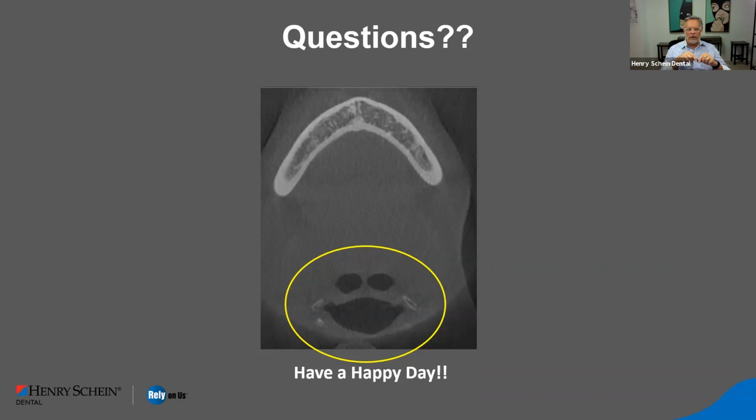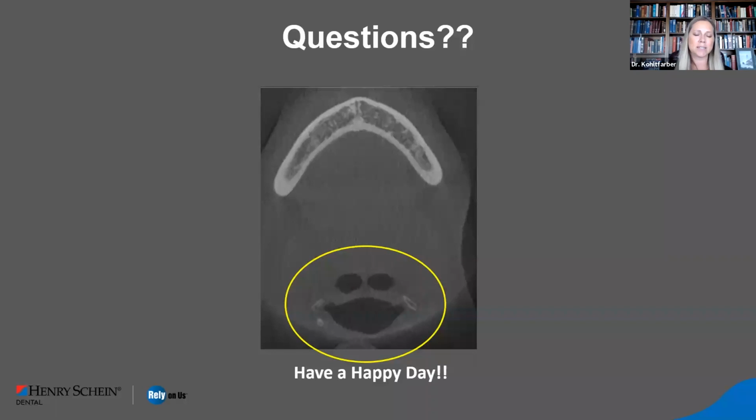What about, I think it was during the pandemic, the CDC came out, or ADA, saying not to take intraoral, and now some systems propose extraoral bite wings. What's your feeling on those? That's a great question as well. Definitely, during the pandemic, I think it was even more reason to get a CBCT personally, and those extraoral bite wings.